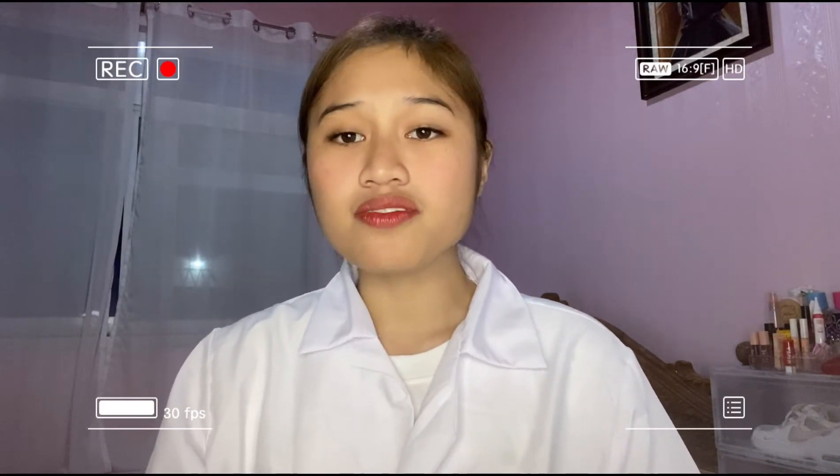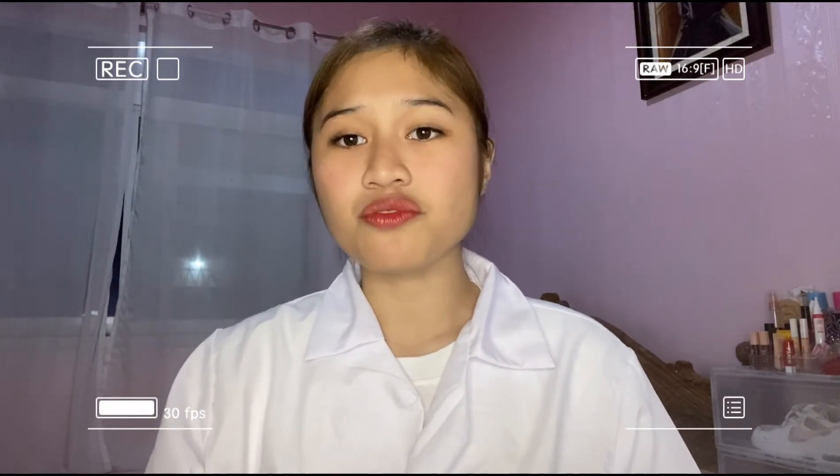Good day! I am Julian Diniz Gregorio from the LBC High University of Science and Technology, College of Nursing, and I will be your student nurse for today. I will present a procedure on providing urinary catheterization. Catheterization involves passing a rubber or plastic tube into the bladder via the urethra to drain urine from the bladder or to obtain a urine specimen.